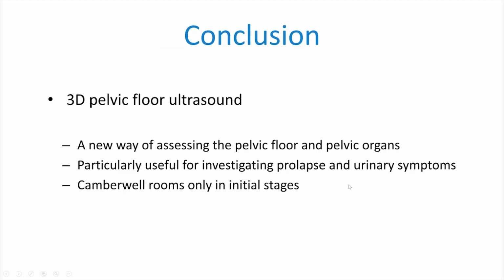So in conclusion, pelvic floor ultrasound is a new way of assessing the pelvic floor and organs, and it's really changed these things very dramatically. It's particularly useful for the investigation of symptoms of prolapse and urinary incontinence. It's completely reasonable for general practitioners to refer to us for this test.